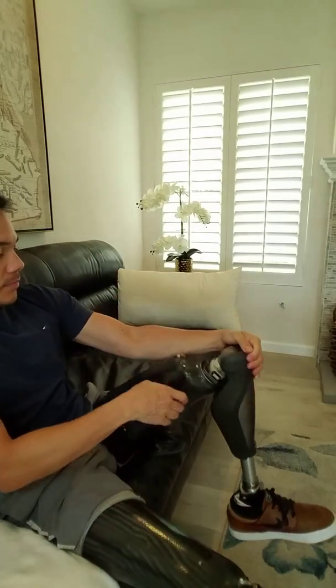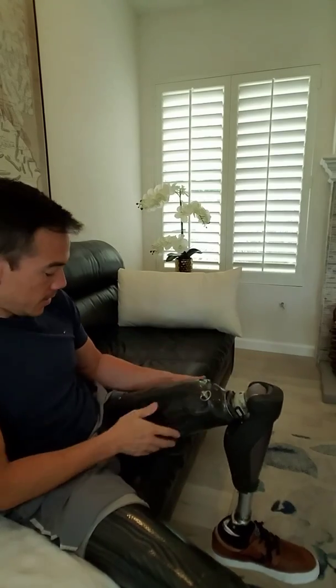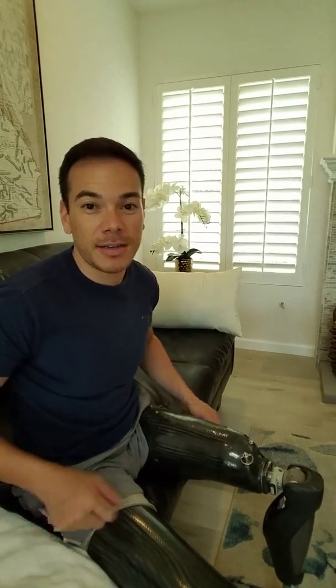But if I put it back on, you can see how low the trim line is here. It's really low. It doesn't cut into my groin — I don't feel it at all. It's not an issue for me.